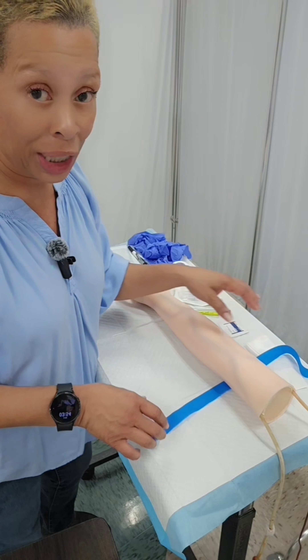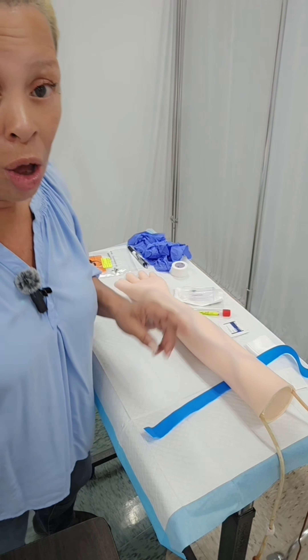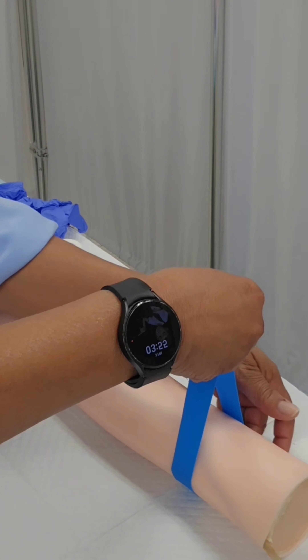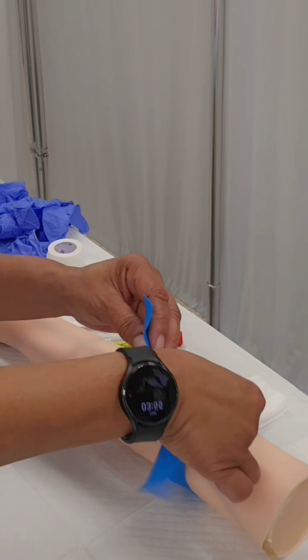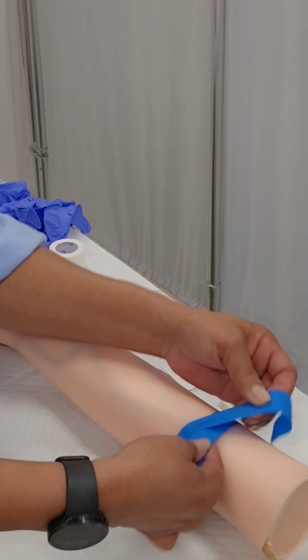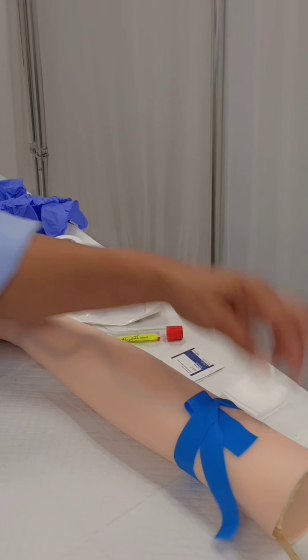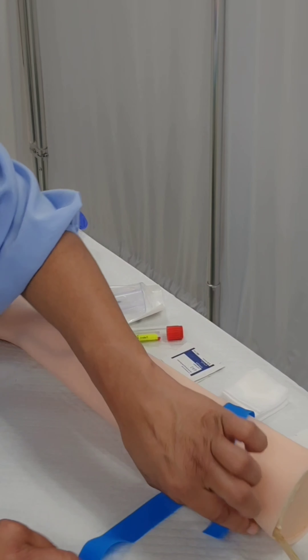I'm going to show y'all close up how I tied my tourniquet. I'm just wrapping it around the person's arm, making sure that there are no twists — the tourniquet is flat and it's straight. You don't want twists because that could be painful and discomforting to the patient. Now I'm crisscrossing and then taking one end in and making a slip knot. That way I know which tab to pull — I pull the tab that has this little slip knot in it, and then voila — easy peasy.